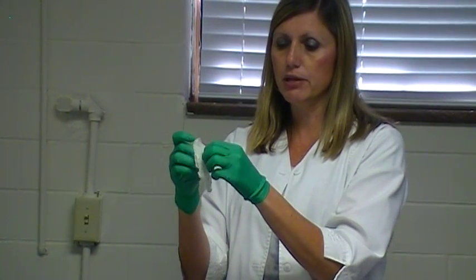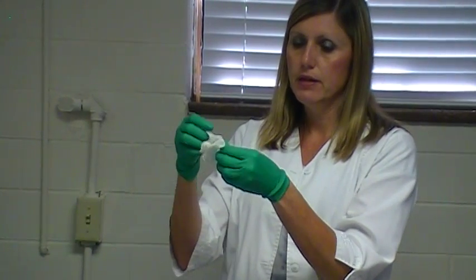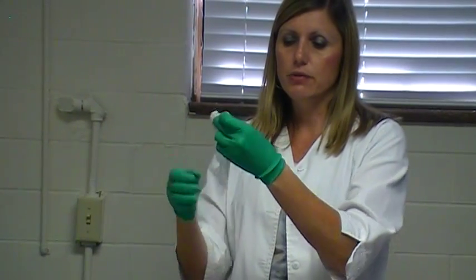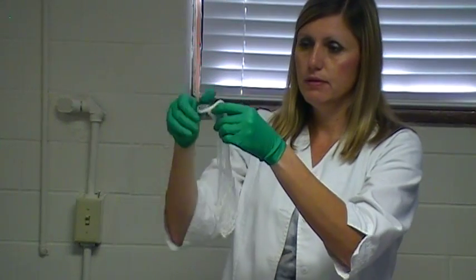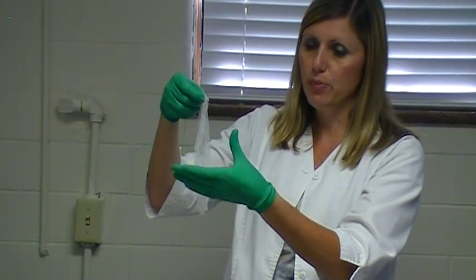The next thing I'm going to do is what's called fluffing my gauze. Now, fluffing your gauze is simply opening your gauze so that it's ready to be packed into a wound. You want to make sure you've opened it completely.